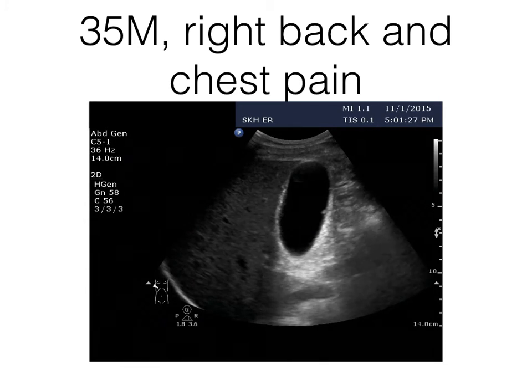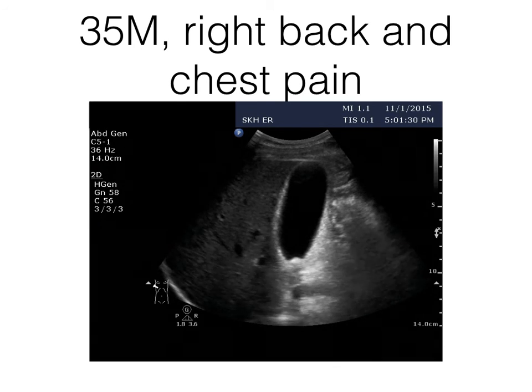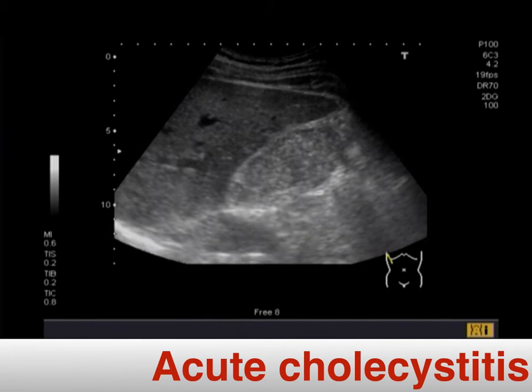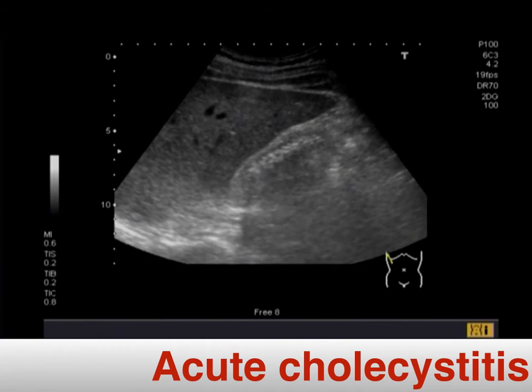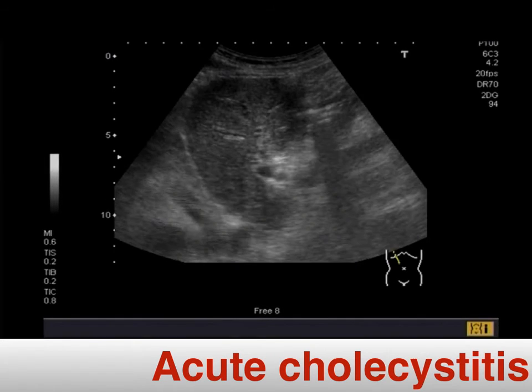The gallstone is here, and the patient's echo Murphy sign cannot be demonstrated on video, based on your practice, all right? And here we can also see the polyp. Can you see the gallbladder? The gallbladder is full of sludge and stones, so we call it the wall-echo-shadow sign. The wall, minimal fluid and a lot of stones: wall-echo-shadow. That is a kind of diagnosis you will miss if you do not look carefully.